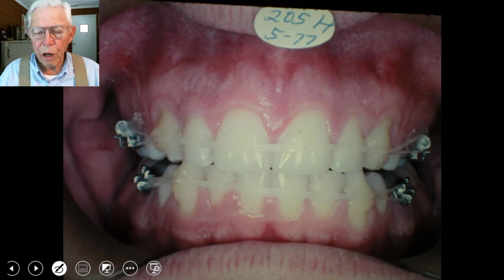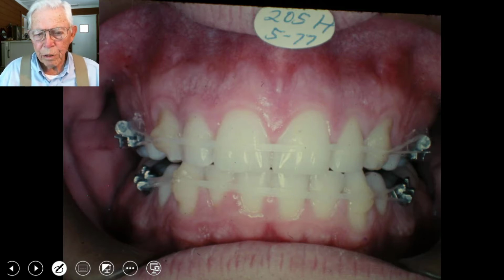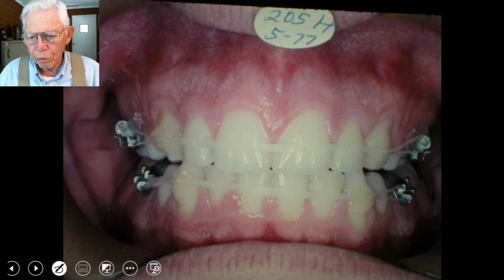We used the occipital headgear to bring that up. And there's several things here. We taught him how to chew and bring his jaw forward and keep it, press it down, breathe through his nose, and everything, and closing the space up.